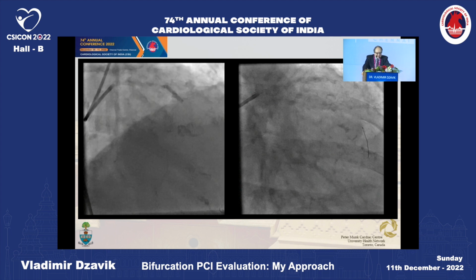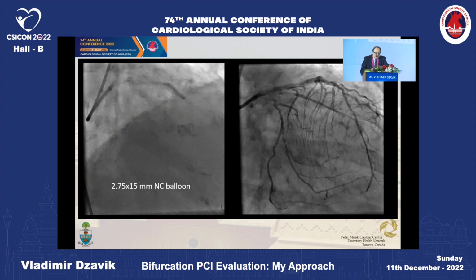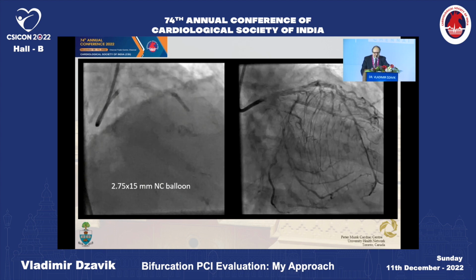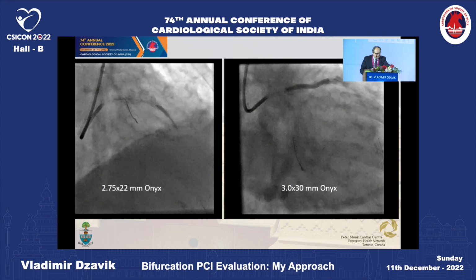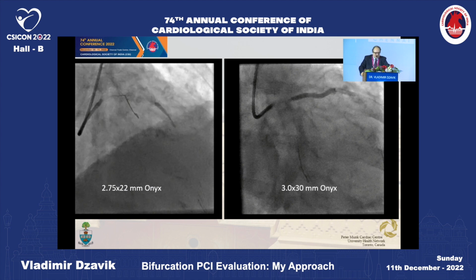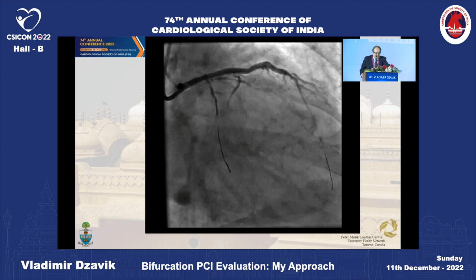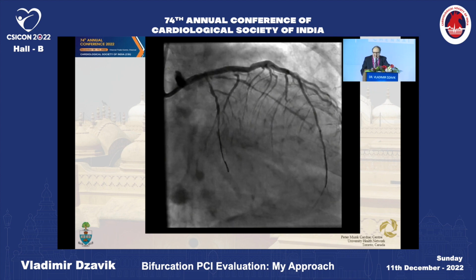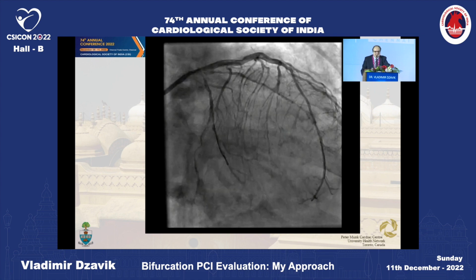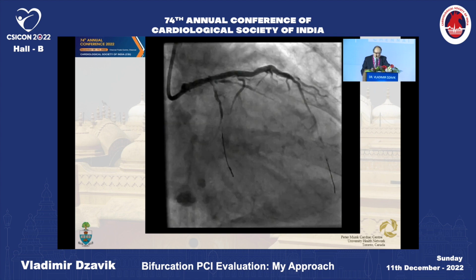As you can see, after modification, the NC balloon actually expanded very nicely. We then optimized the entire proximal segment to where we needed to, and we had a decent result. We then deployed 2 stents, one in the distal segment, one in the proximal segment, overlapping, as you can see, and had a very nice result in the LAD at this point. So now what do you do with this circ bifurcation? It really is a 001, so obviously an ostial circumflex with also very diseased OM.